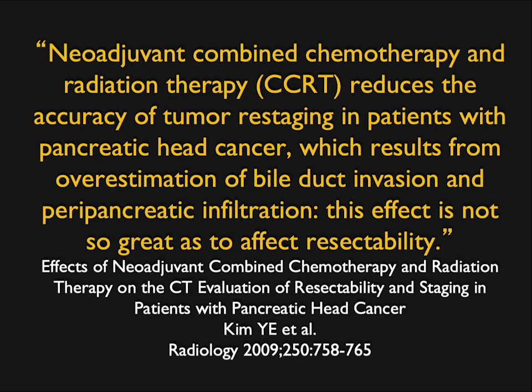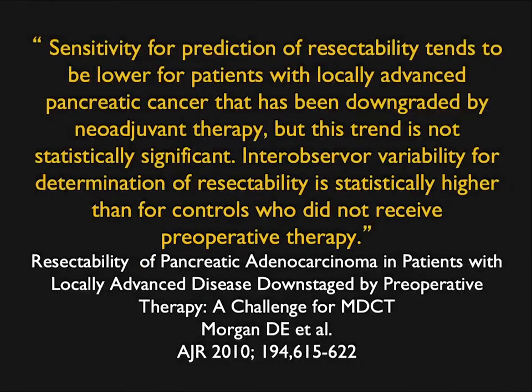Some people have used PET, but that's not helpful. And so this article again by Morgan: sensitivity for predicting resectability tends to be low for patients with locally advanced pancreatic cancer that has been downgraded by neoadjuvant therapy, but this trend is not statistically significant. Inter-observer variability for determination of resectability is higher than for controls who did not receive pre-op therapy. That basically means if you've seen a lot of cases, you probably tend not to overcall things.